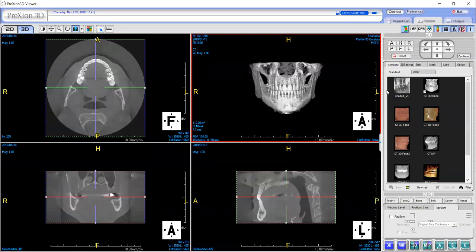Hello there, this is Jennifer with Prexion. In this video I will be covering your toolbar section, which includes some of your basic tools such as the manipulation of your crossbars, slicing, window level, pan, and zoom.